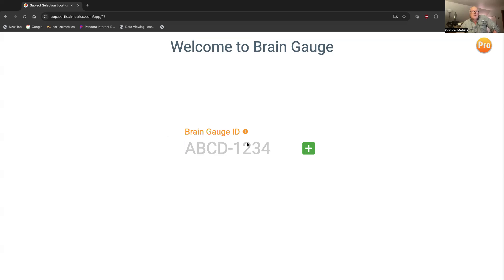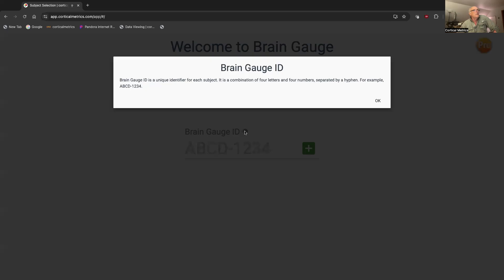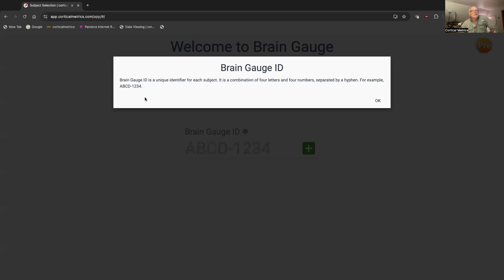That means the subject identification. If you pop on this little number here, it says BrainGage ID is a unique identifier for each subject. In other words, it identifies whoever is testing. It's not unique to the account, it's just an identifier for the person who's testing.